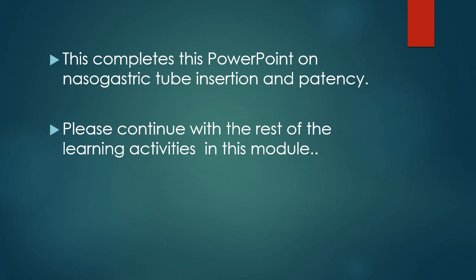So in summary, NG tube insertion is a nursing procedure. It requires a doctor's order. It's a clean technique, but you are required to use personal protective equipment that is appropriate for the situation. It comes with a number of complications, so it's really important that you practice the skill of NG tube insertion and you are aware of the nursing interventions that are associated with the care of a patient with an NG tube.